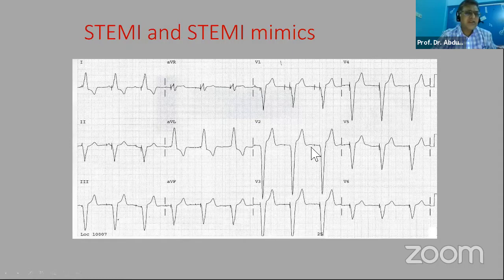So that means there is an electronic signature before each complex, both atrial and ventricular. That's why he's saying AV pacing, atrioventricular pacing. And whenever you have a pacing ECG, you cannot rely on the ECG. Rather, you should go for the history, look at the echo and the troponin result, and then decide about your treatment approach.